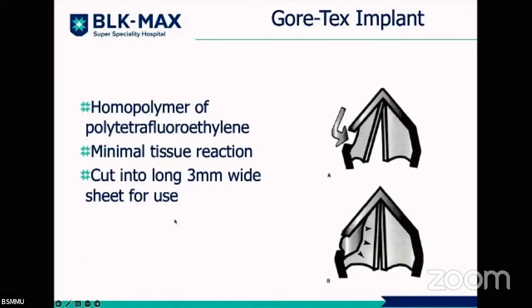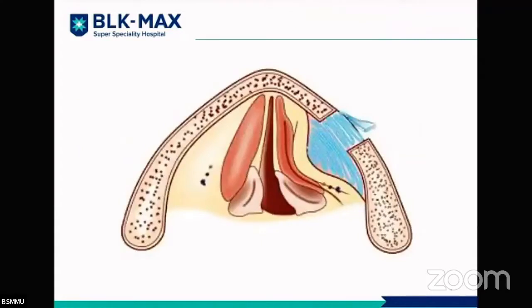Gore-Tex, I'll be showing you a Gore-Tex video. Gore-Tex is available in CTVS theater. You can ask your CTVS colleagues to give you Gore-Tex. It is very nice. You can put it just like as you pack the nose with ribbon gauze, in a similar manner, you have to keep on packing till you get a satisfactory result.